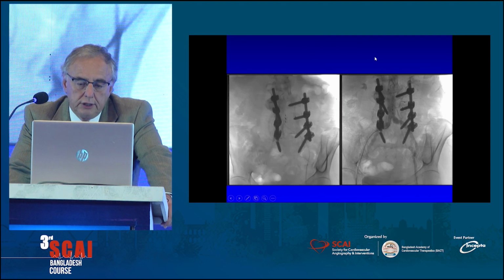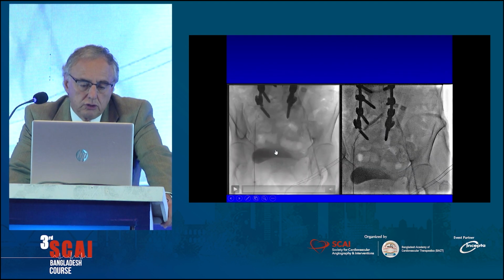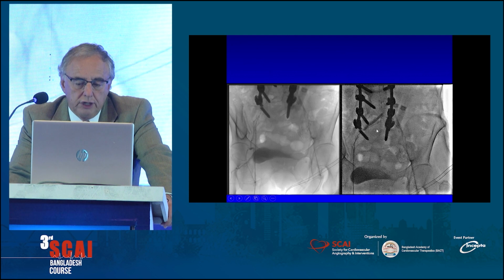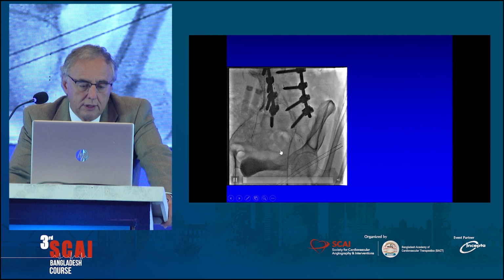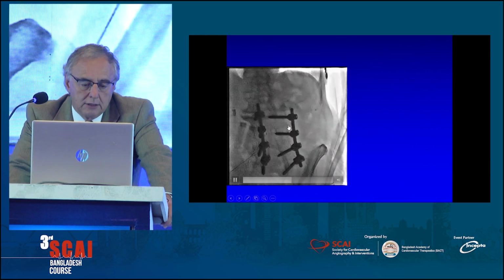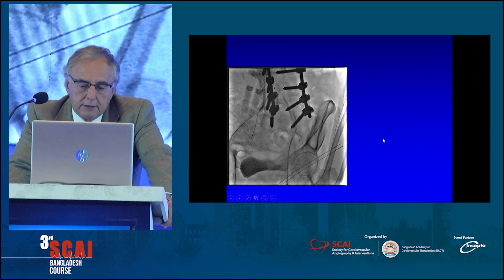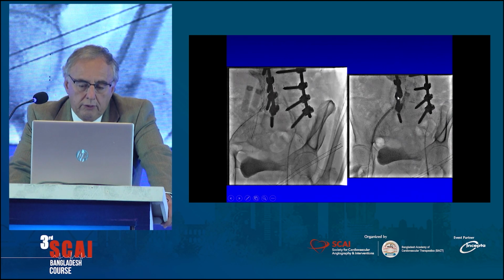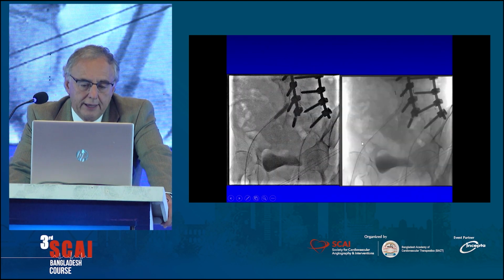So I switched the intervention to go from the opposite side, and I did a reverse CART, and you see here the balloon inflated, and then after I inflate the balloon, I go with my wire retrograde into the lumen, and it will go up into the aorta. So now I'm in the true lumen. After that, I balloon antegrade and continue doing the whole segment with balloon, and then I put a stent.